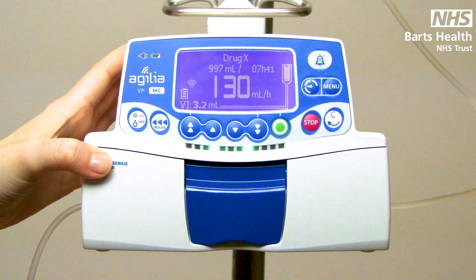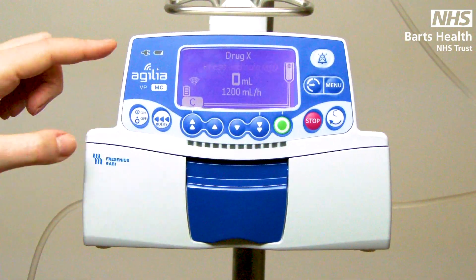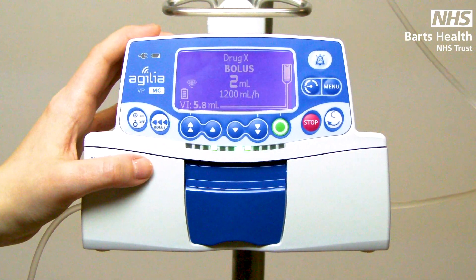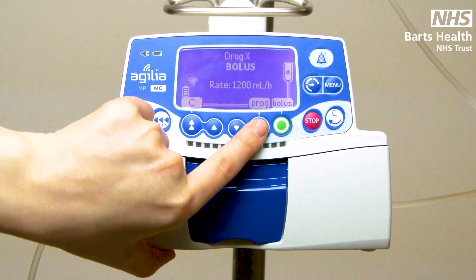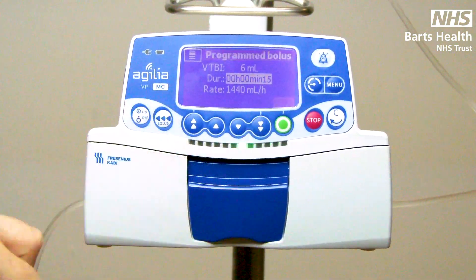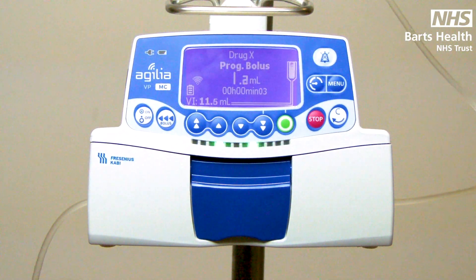There are two ways of bolusing your drug on the volumetric pump. Press your bolus key once and both options will be indicated at the bottom. First is manual bolus — press your green key, then press and hold your bolus button as the pump indicates. As long as you are holding, you are delivering the bolus. Once you release the key, the bolus stops and returns to your original rate. To program bolus, press your bolus key once and press the soft key under prog. Here you can enter how much of a bolus you wish to give and how long you wish to give it over. The fastest this pump can run is 1500 mls per hour. Press green to start. Once your bolus has run through, you will go back to your original rate.